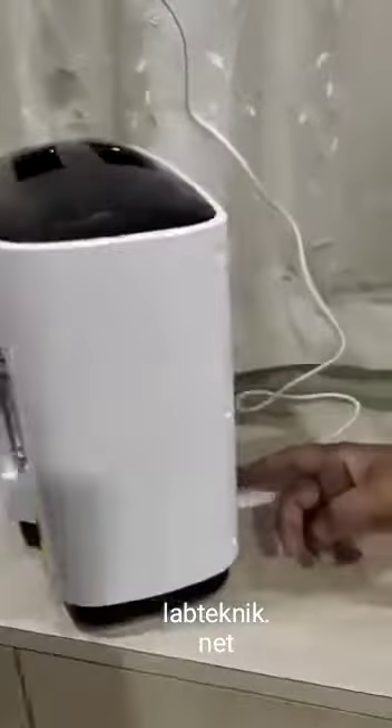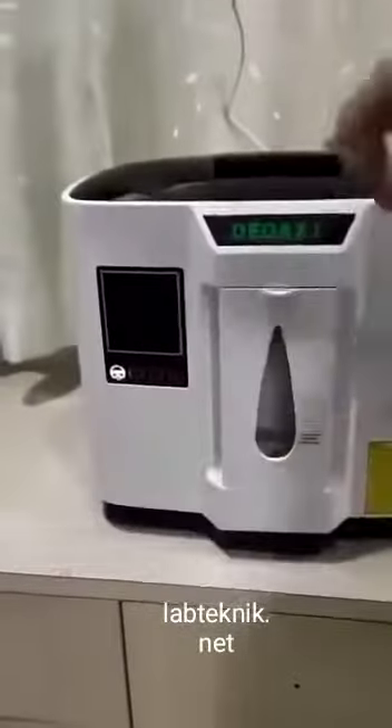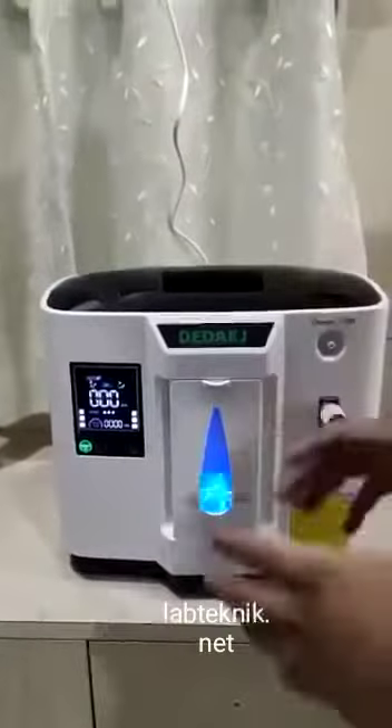Switch on the plug and then the switch at the back. Now you can see the machine is on. Then switch on this machine — it starts generating oxygen.